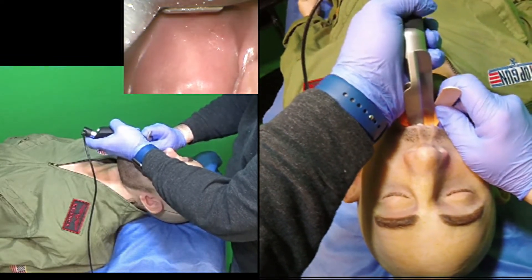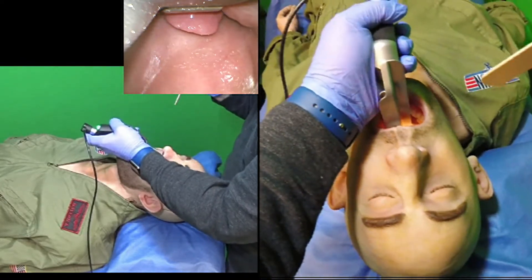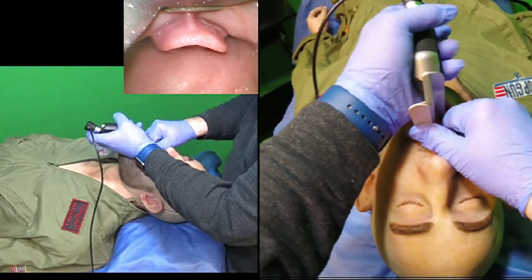I'm going to perform the laryngoscopy right over the top of the tongue depressor and take the tongue depressor out when it's no longer of any use. If I want to protect the teeth, I can put the tongue depressor between the laryngoscope blade and the upper dentition.